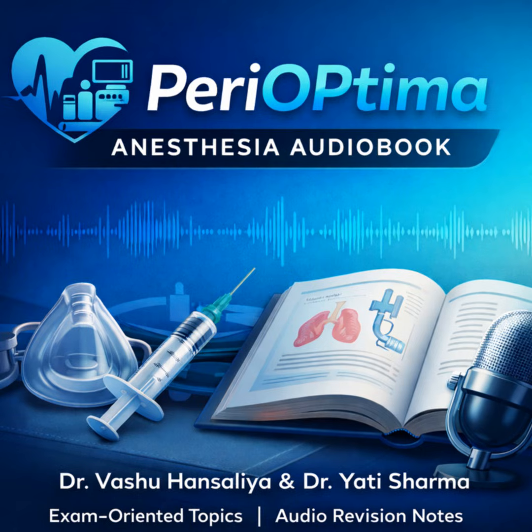So it serves a dual purpose. It does. It prevents multiple vaporizers being on at once, and it also ensures that the vaporizers are correctly seated and tightly aligned to prevent any leaks. We also need to confirm the correct positioning of vaporizers in relation to the flow meters. For standard variable bypass vaporizers, they are always positioned downstream of the flowmeters, but upstream of the common fresh gas outlet. So after the gases are mixed, but before they go to the patient circuit. Exactly. This precise positioning ensures that the total fresh gas flow rate is established before it enters the vaporizer, which allows the mechanism to accurately calculate and deliver the desired concentration of saturated vapor into that total gas mixture.